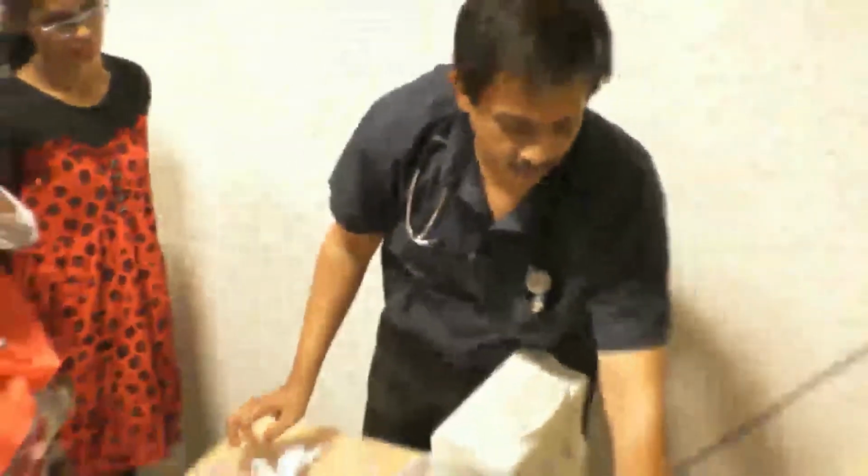What is seen is that for every 1 inch or 2.5 centimeter the heart is offset from the reference value, a 2 millimeter mercury change in pressure is recorded. So, say 10 inches, if it stays 10 inches below, how much will the pressure change? 20 millimeter of mercury more. And if it is 10 inches above, 20 millimeter of mercury, it will falsely record arterial blood pressure.